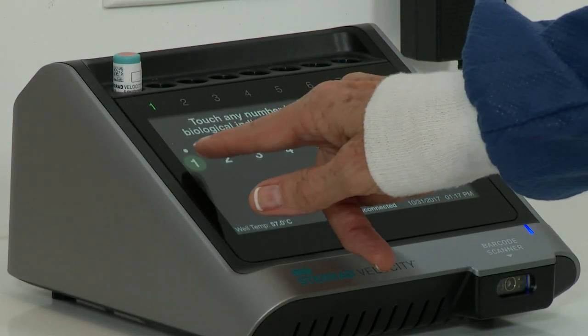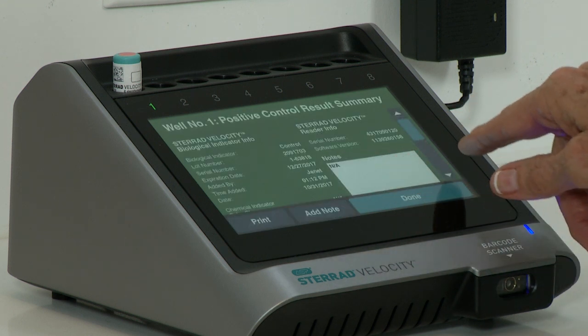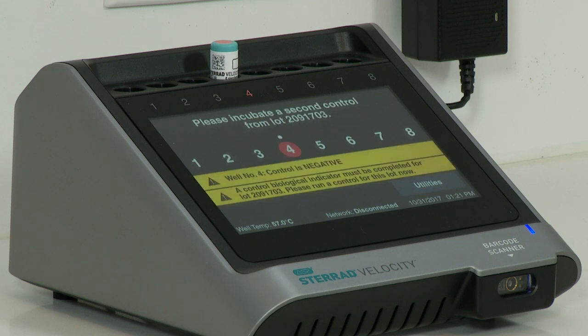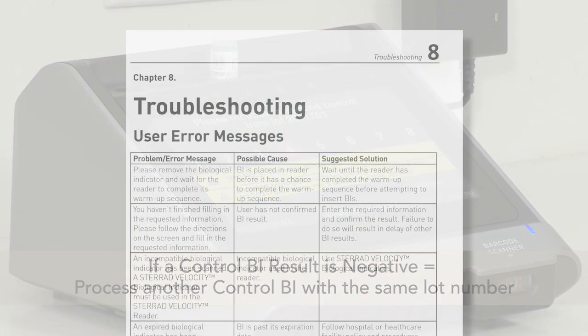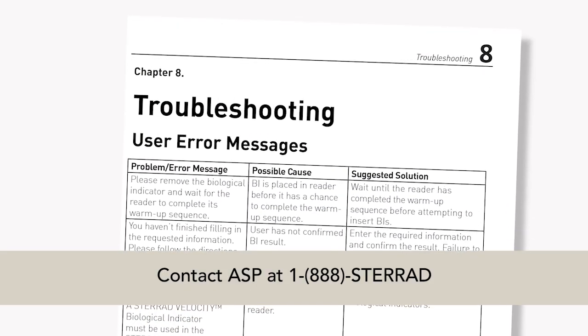A positive result on a control BI indicates that both the reader and the BI are functioning properly. A negative result on a control BI could have several causes. Refer to the troubleshooting section of the STERAD Velocity Reader User's Guide for detailed instructions. If a negative result is observed, repeat the test with a second BI from the same lot number as the BI which had a negative result. If the second BI is also negative, consult the STERAD Velocity Reader User's Guide troubleshooting section and contact ASP.